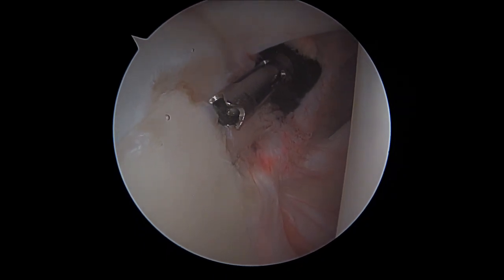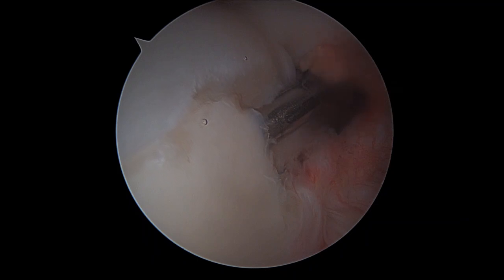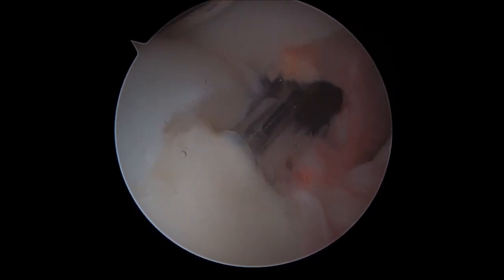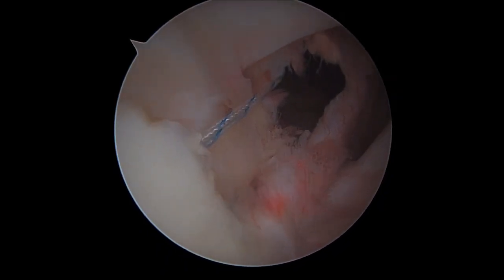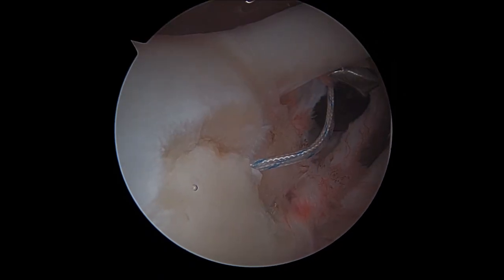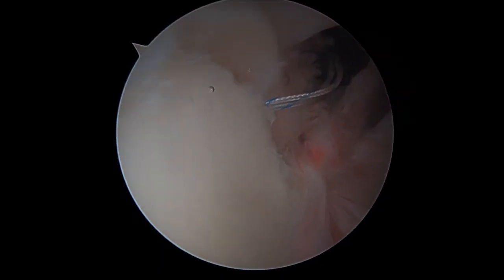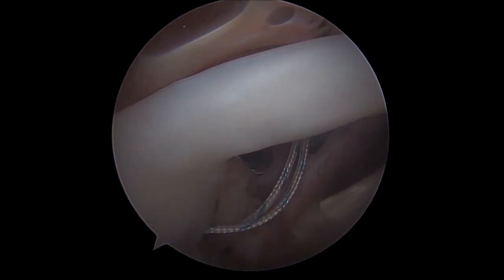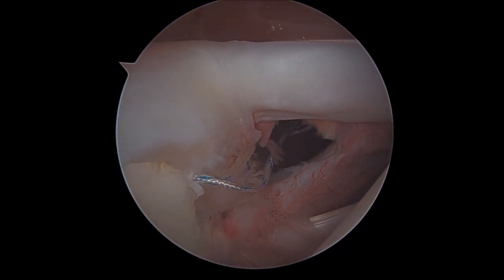What we do then is to repeat the same steps a little bit further north than before, just beneath the insertion of the long head of biceps on the north pole of the glenoid. This is a crucial aspect because we have to avoid over-constraining and over-stiffening the intra-articular portion of the tendon, and we have to be very careful when we pass our suture through the anterior superior aspect of the labrum. By our penetrating hook, we perform the same step, going through the anterior superior aspect of the torn labrum and recovering one of the two sutures.